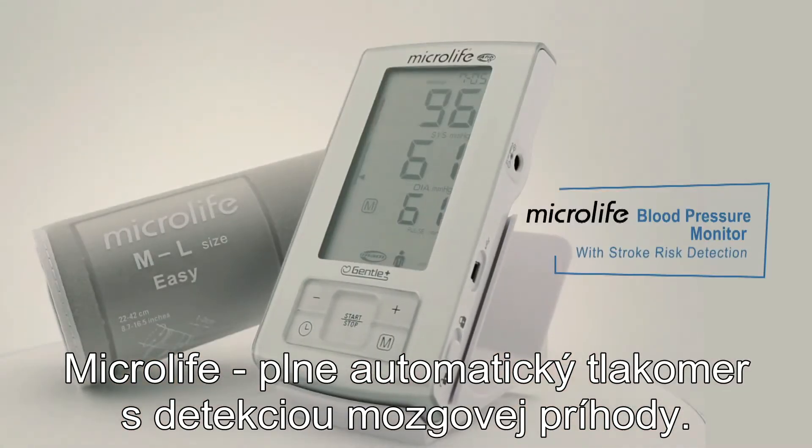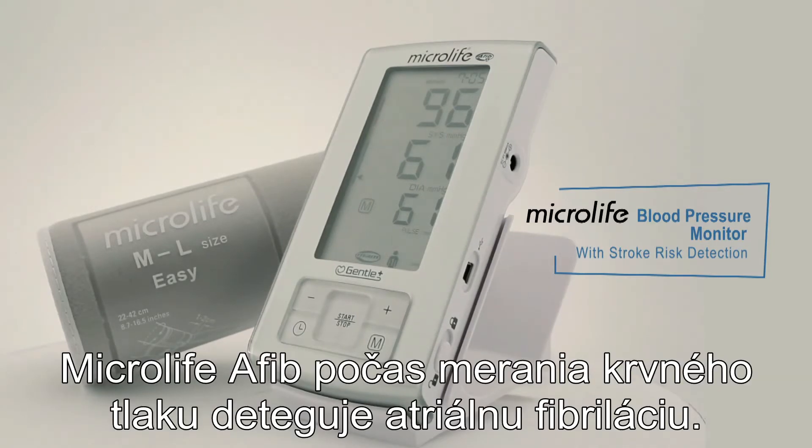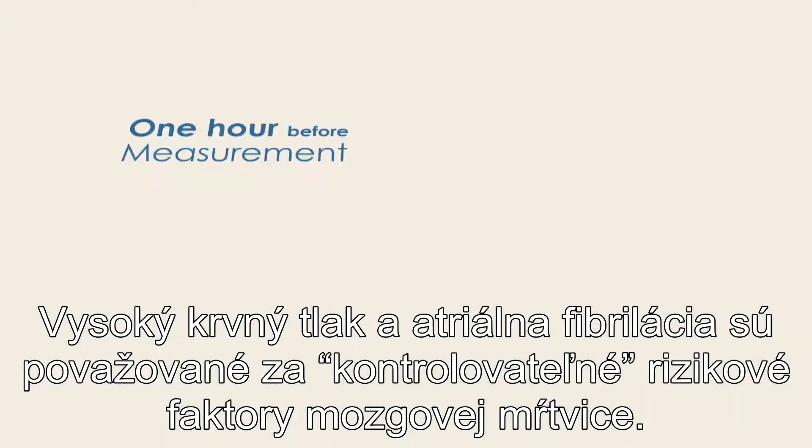Microlife fully automatic upper arm blood pressure monitor with stroke risk detection. Microlife Afib screens for atrial fibrillation while taking your blood pressure. High blood pressure and atrial fibrillation are both considered controllable risk factors for stroke.